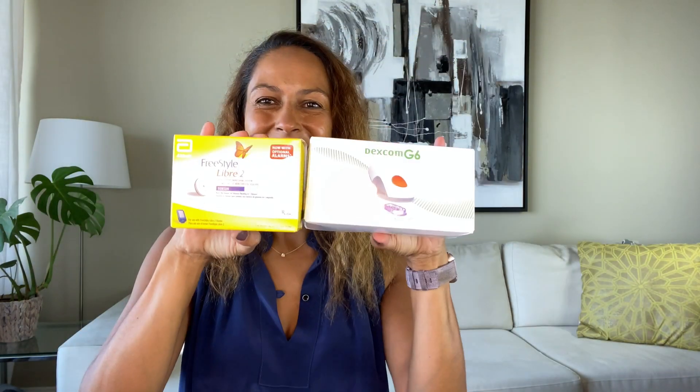I am Christelle from Diabetes Strong and in this video I'm going to give you a direct comparison between the Dexcom G6 and the Libre 2. I've been wearing the Dexcom G6 system since it came to market and I've loved it, but it also has some downsides. When I got my hands on the Libre 2 sensor I thought, why not wear both sensors at the same time to get a direct comparison and a better feel for which system I prefer. This is my personal experience and I can't guarantee you'll have the same experience.